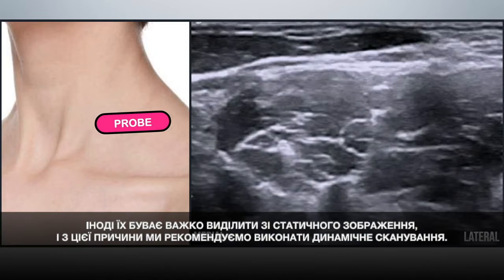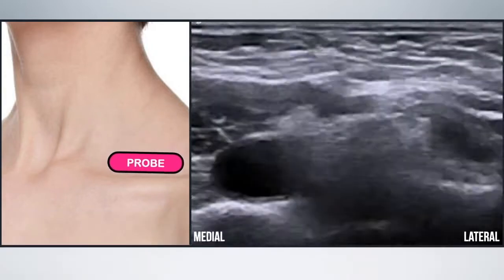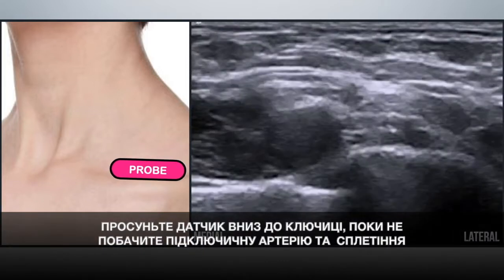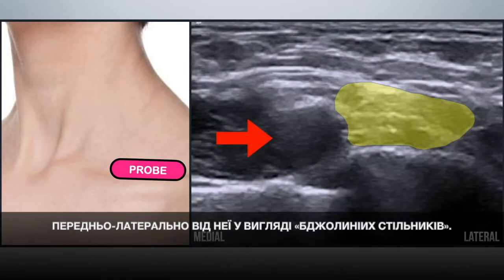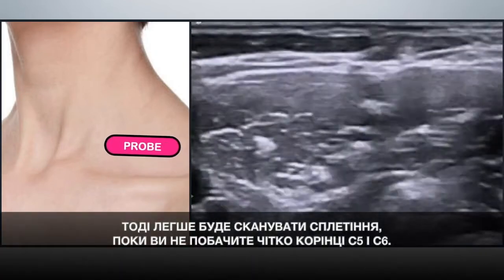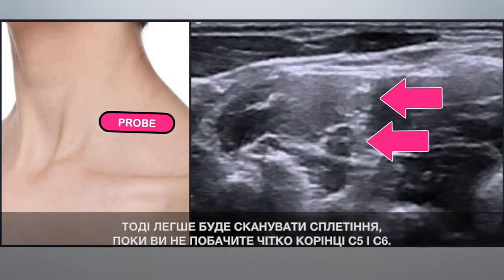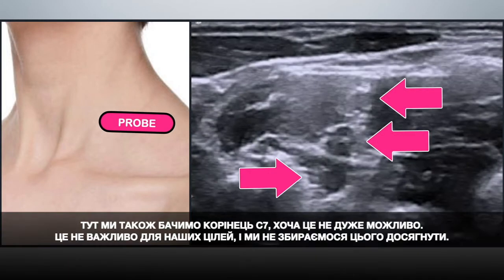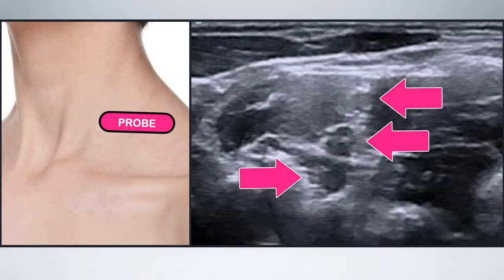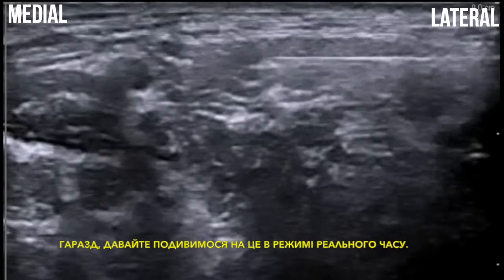Sometimes these roots can be hard to pick out of a static image, and for that reason we recommend doing some dynamic scanning. Slide the transducer down to the clavicle until you see the subclavian artery and the honeycomb of plexus anterolateral to it. The artery makes a great landmark. Then it's an easier job to scan up the plexus until you see the C5 and C6 roots distinctly. We see the C7 root here too, although you may not always. It's not important for our purposes and we're not going to target it. Now that your probe is in the right position, the needle can be lined up and advanced from the lateral aspect.